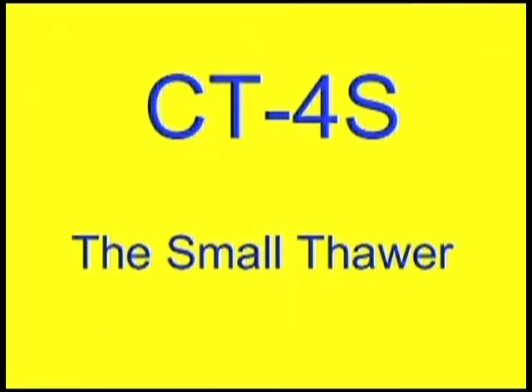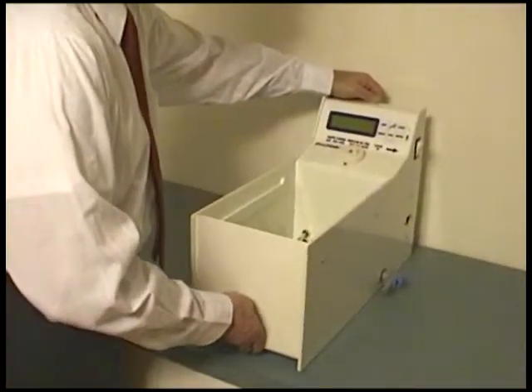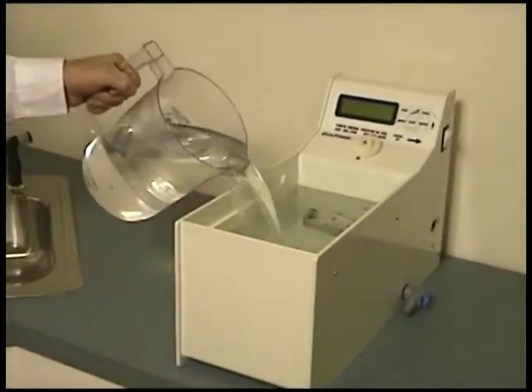The Cytotherm 4S — the small thawer. Just place the Cytotherm 4S on a counter, and fill with water up to the middle of the rail.